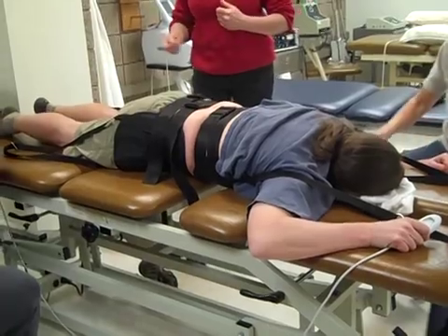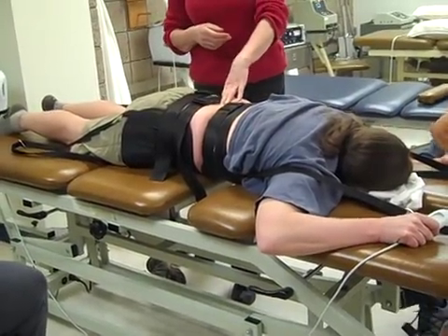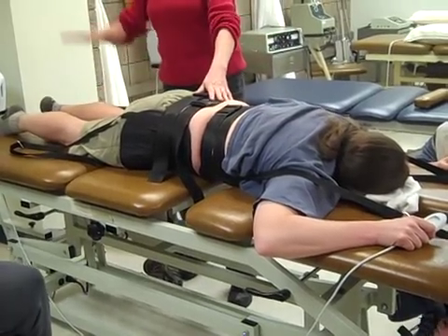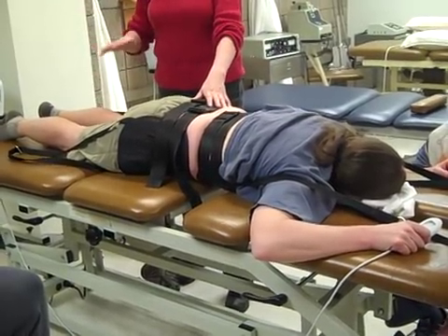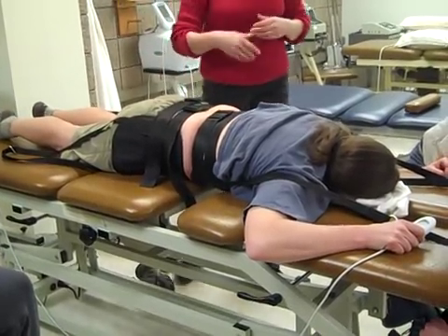Now he was saying that his feet were going to sleep. So he doesn't have a disc problem. And so we were pushing. Plus, we should have probably raised and lowered that table a little bit to find out where it would have been, and that would have relieved that zingy.